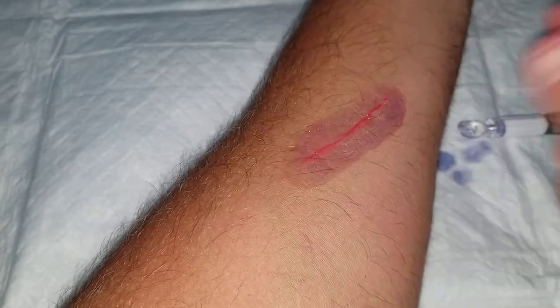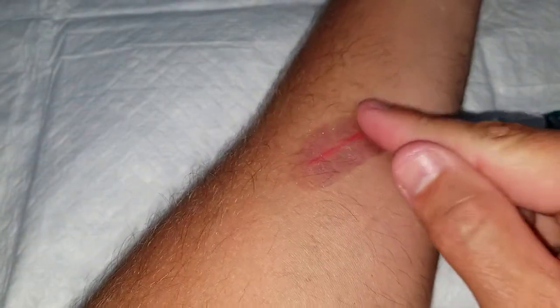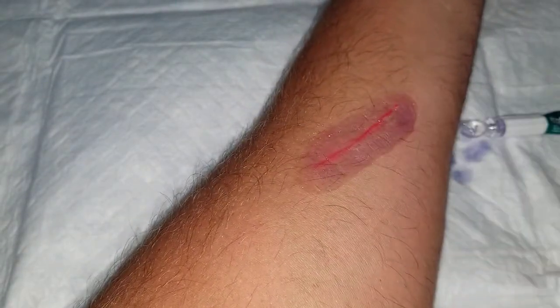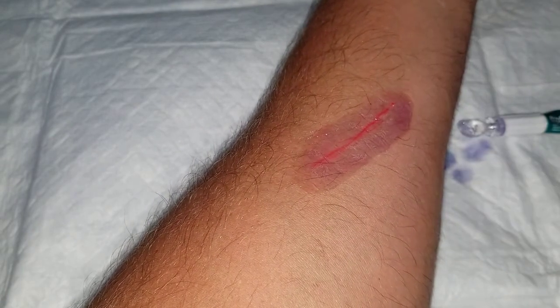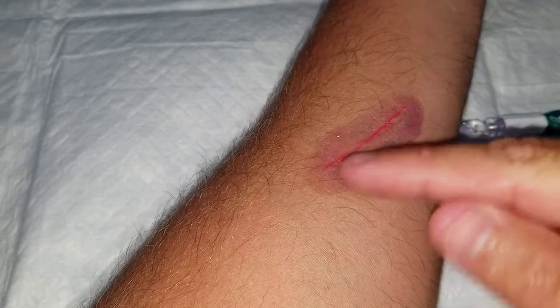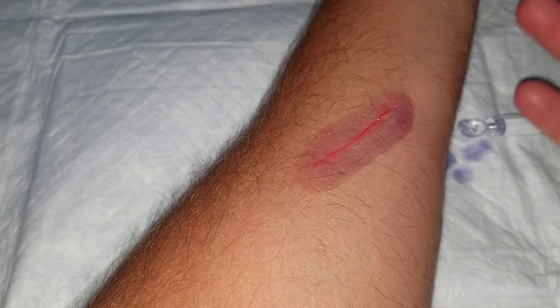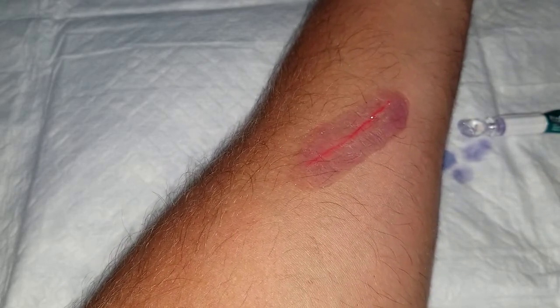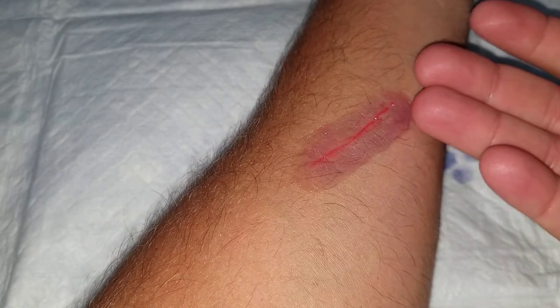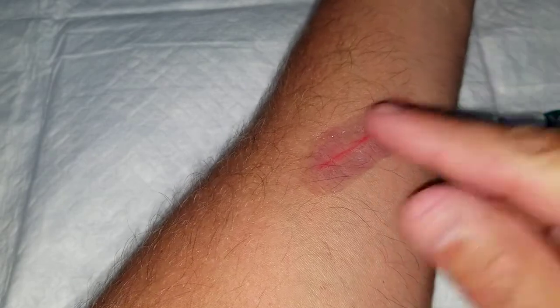It's pretty tough now. I want to give it just a little while longer. The longer you give it to cure, the better chance you've got at removing the entire piece in one pull. Now, granted, I'm doing this over a simulated wound on my arm. If it was a real serrated wound, with a lot of gaps and stuff, it may not work as well, but it should be able to, depending on how thick you have this glue on top, pull all that remaining glue off. And like you can see on my arm, it's pretty thick.